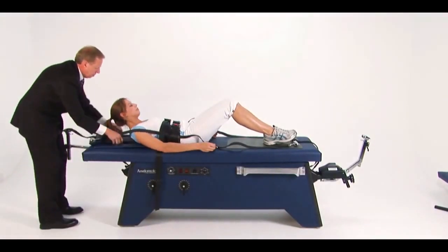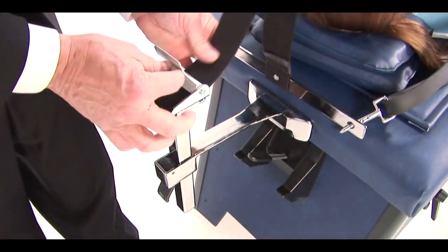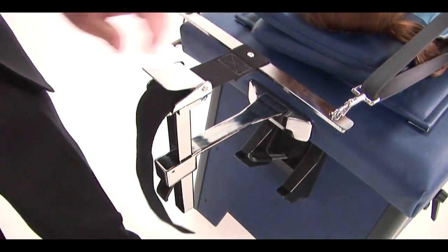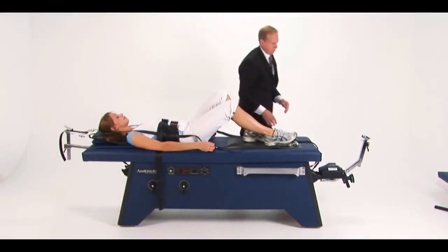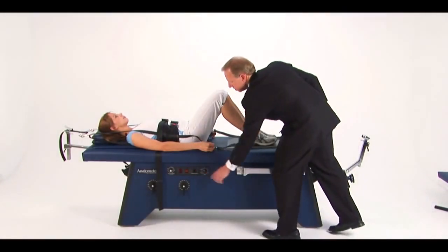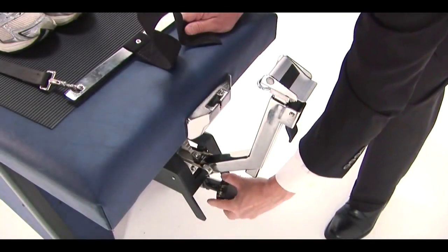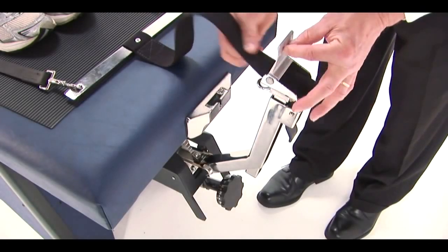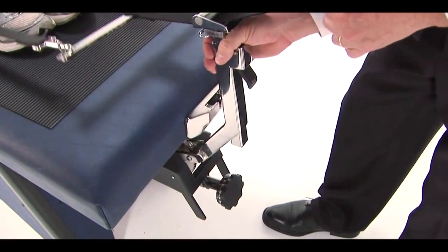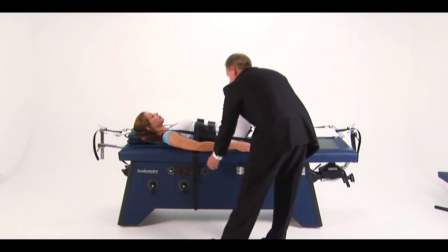Next, secure the web strap of the thoracic harness in the counter traction unit at the head end. Generally, having the counter traction bar as far down as possible inside the assembly will provide the correct angle of pull, directing traction to the center line of the patient's spine. To secure the iliac harness, switch the table to lumbar and make sure to turn the poundage all the way down. Only then can you bring the traction control unit up several inches towards the table top. In this position, pull the web strap through the self-locking buckle and take out the slack. The patient is now ready for treatment.